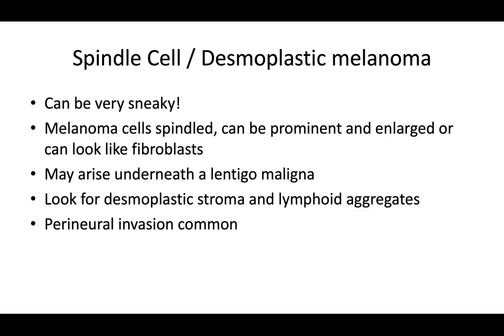And unfortunately, desmoplastic melanoma loses expression of other common melanocyte markers, such as Melan-A or MART-1 and HMB45. So you can't use the traditional melanocyte-specific stains of Melan-A or even HMB45 to help you in these types of melanomas. There is that PRAME stain that I mentioned, which is positive in up to a third, depending on some of the studies, of desmoplastic melanoma.